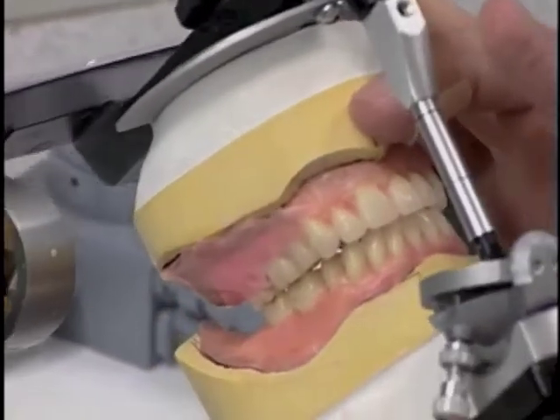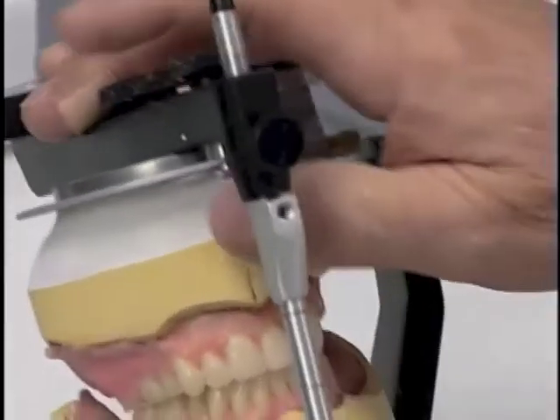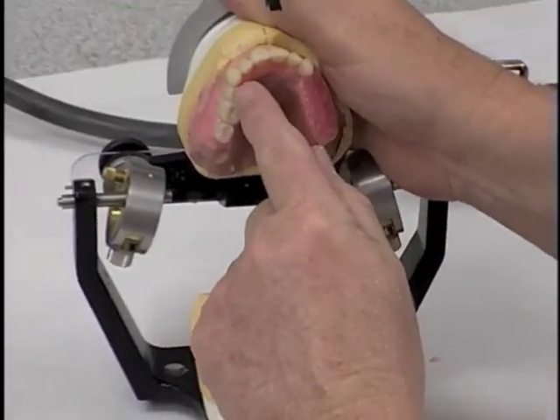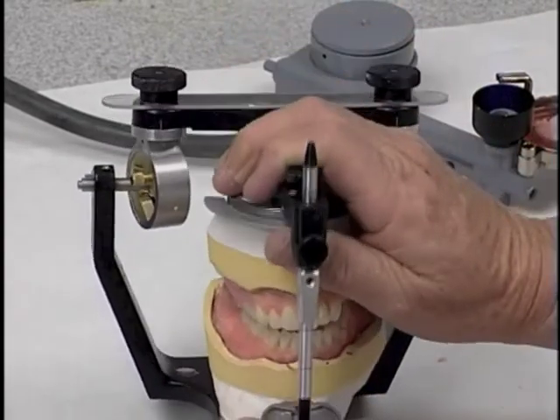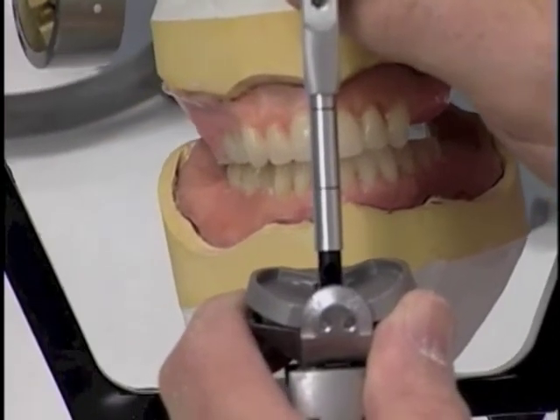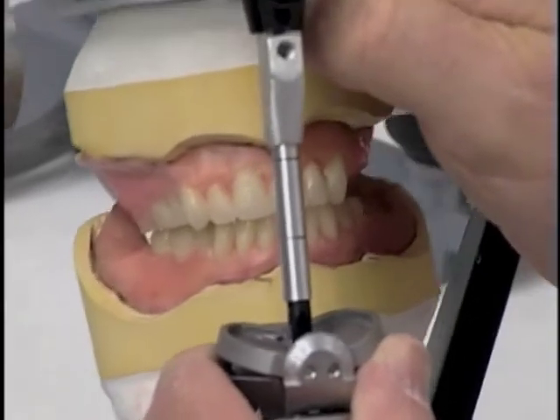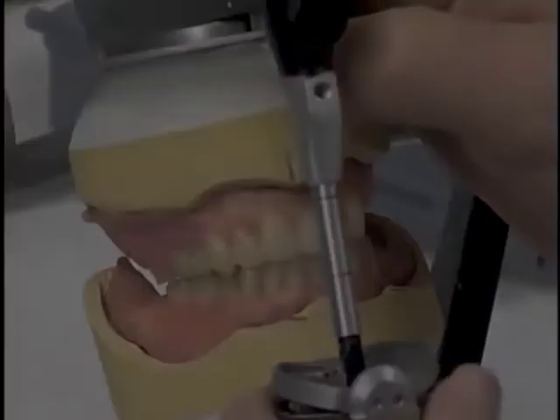The teeth are nice and flat and occluding with the lower teeth in a good form. And also when we look at it from the occlusal view, we'll see that the buccal cusps follow our arch form as we come around. And when we look at it from the mesial like this, we will see that the canine turns the corner with the buccal cusps of those posterior teeth falling into the arch form that we've established with the anterior arrangement.